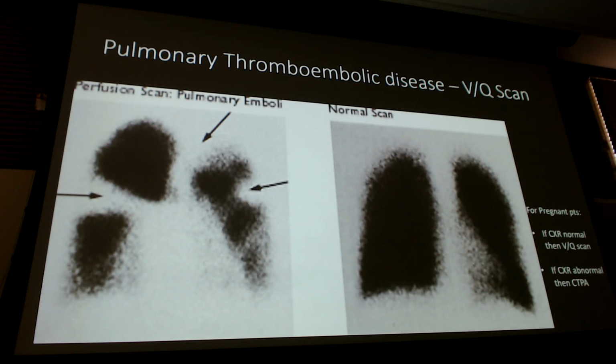A lot of the things we looked at with like nuclear med scans or PET scans, I'm like, what's highlighted like a Christmas tree? In this one, it's the opposite. Where are my gaps? Gaps are abnormalities because they're not getting that blood flow.